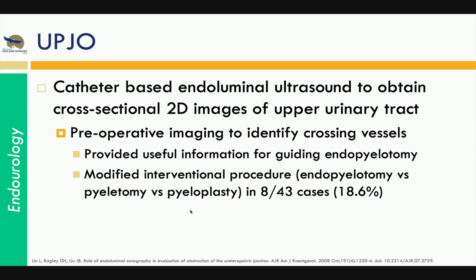And then there was a study that looked at whether using endoluminal ultrasound ultimately changed what people were going to do, as in, are they going to do a pyeloplasty versus an endopyelotomy, or is there something else like a cancer that needs to be addressed? And it actually changed the interventional procedure they ultimately chose in almost 20% of the cases, which I think is pretty significant. One out of five cases it changed.